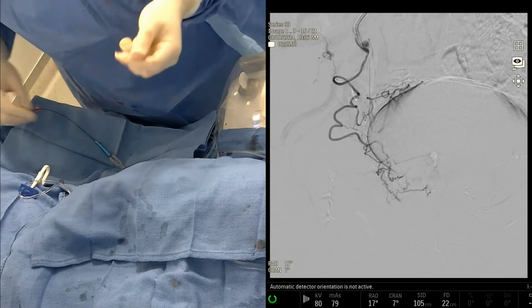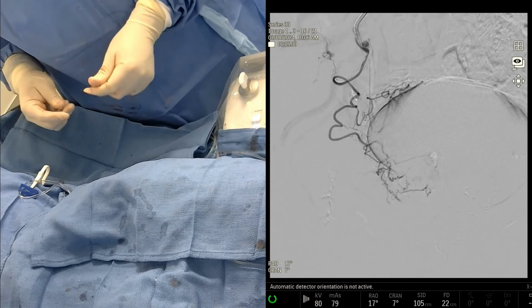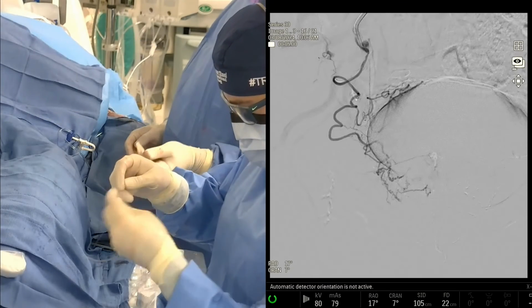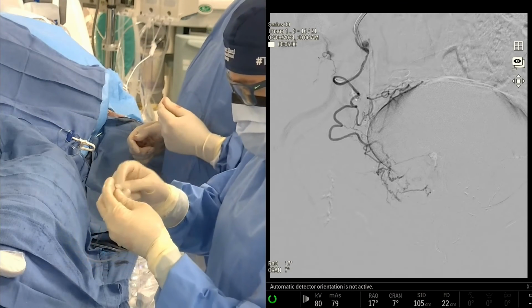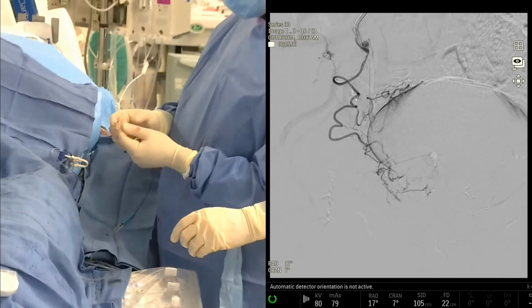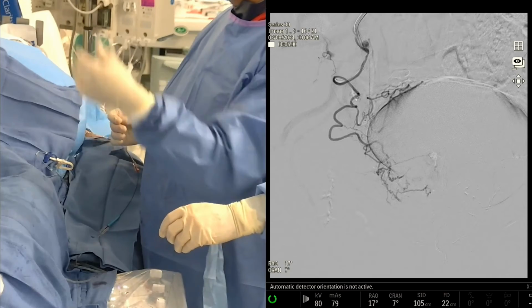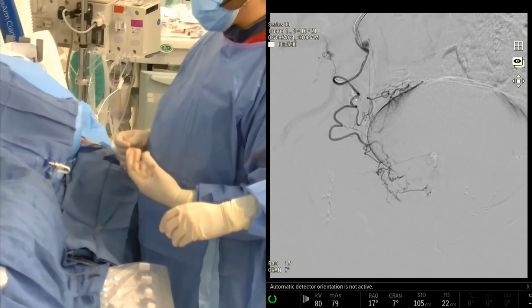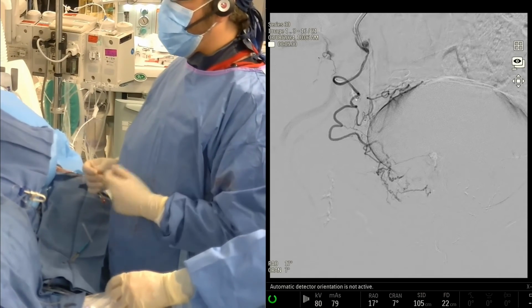I apologize. Well, I think it's a nice example, when we were getting into that. Do you guys see what I was talking about? The bottom part of the prostate's missing. Now, if you had a balloon, you could theoretically fill those branches by using the intraprostatic circulation to try to send some of that embolic. Pressurize it lower. Mm-hmm. Pressurize it. With an end hole, you typically can't do that.